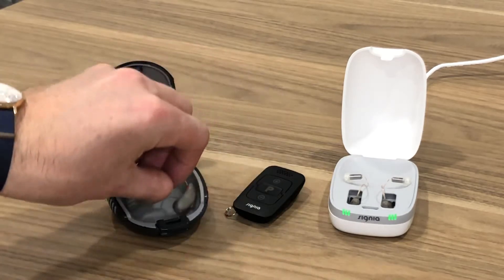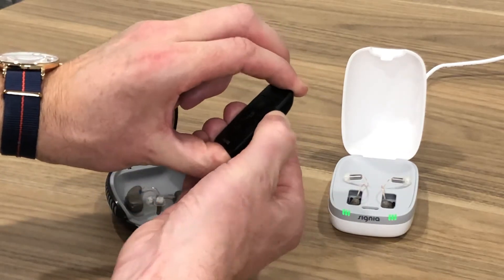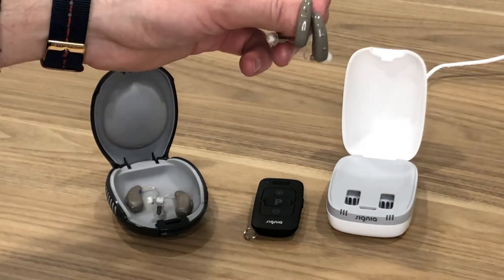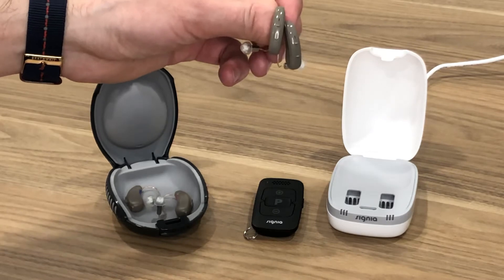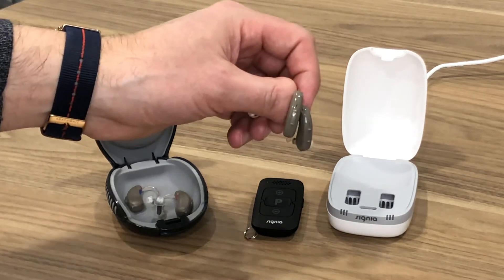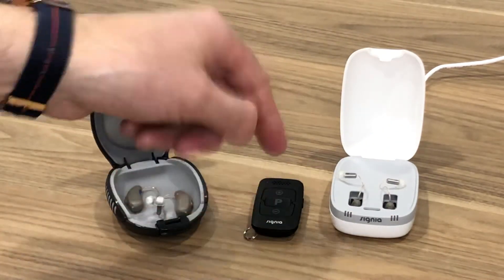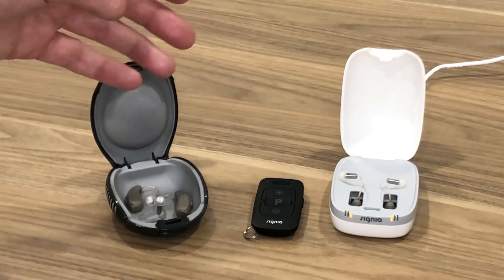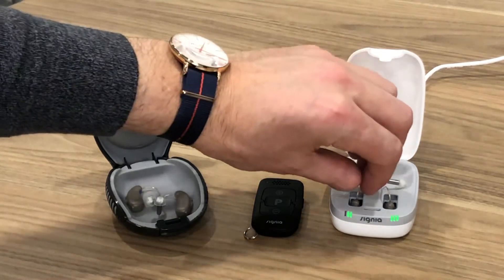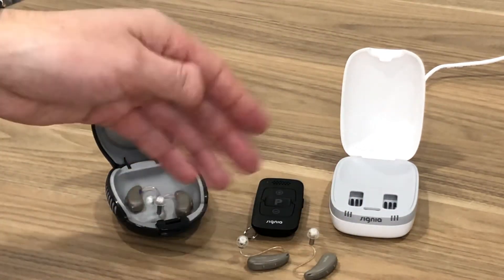Now I'm going to go through the same process with the rechargeable Signia Charge & Go product. Again, we start with the remote in the off position. Assume you were wearing the hearing aids — they're turned on. To turn these hearing aids off, the easiest way is to put them back in the charger. Put them in the charger and leave them for about five seconds because they take a little bit of time to shut off and begin to charge. Then take them off the charger, set them on the table, and give them another five seconds to turn back on.